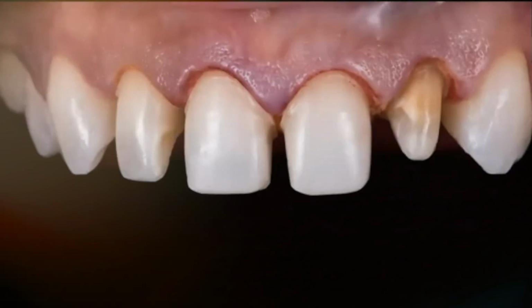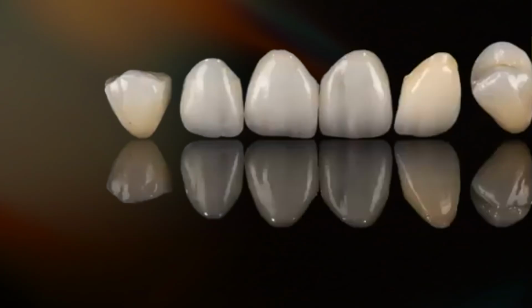So one way to do it when the color is not so severe, when you have like a mild discoloration like in this case, is generally speaking, you prep slightly more. You don't have to prep a lot more. And here, what you can do is you can stain inside or outside of the restoration. And here's an example. You can see that the veneers have different thicknesses, so they are stained differently.